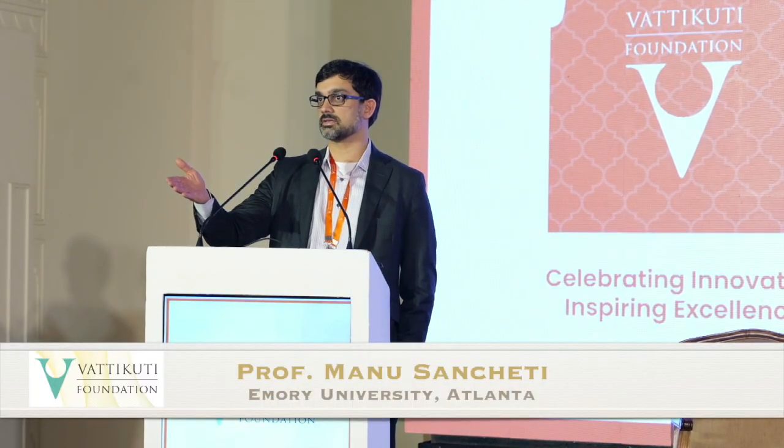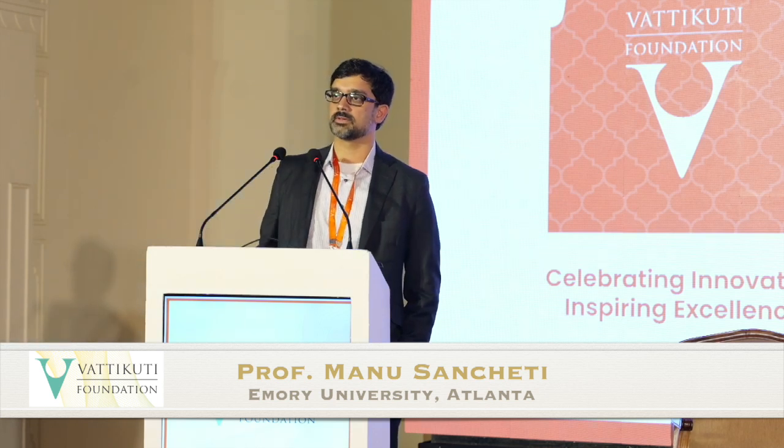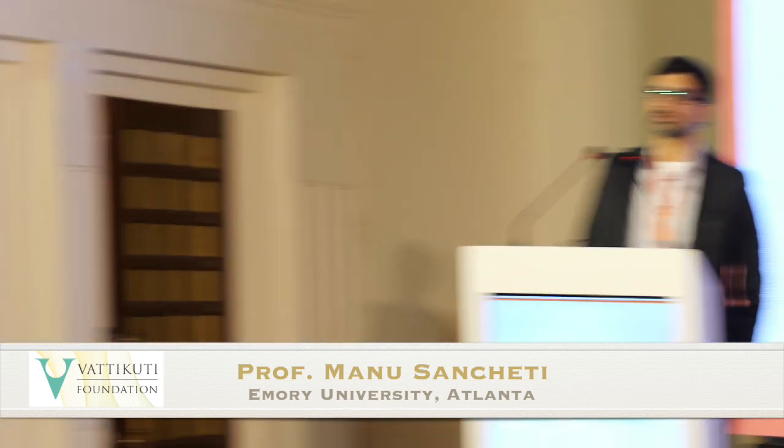Have you tried prone or semi-prone, or have you found you just do the right lateral? Yeah, I just do right lateral because I originally copied the way we did it open. So it's right lateral, and then we slightly tilt anteriorly, so the lung falls away, and you can get into the posterior mediastinum. And you create the conduit inside the thorax.